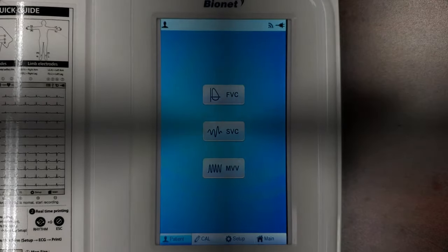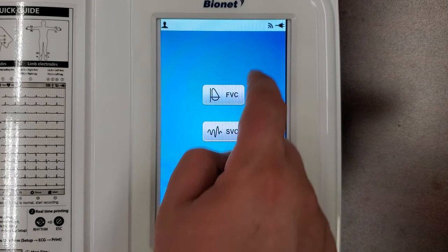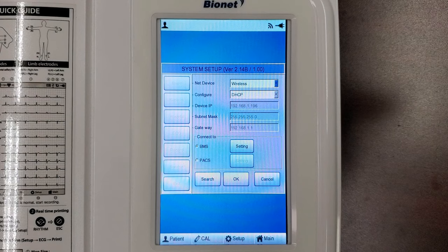To connect your SpyroCare machine to your BMS Plus software, follow the same directions as the wired or wireless connection for the Cardio 7, as both machines have the same structure.